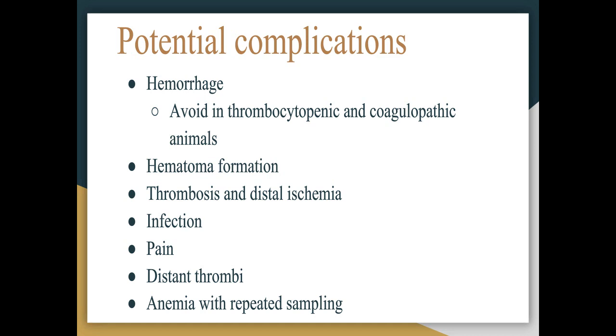Following sampling, it's not uncommon for the artery to spasm after being catheterized or sampled from, and that may make future draws from that artery more challenging as you will not be able to palpate the artery as easily.